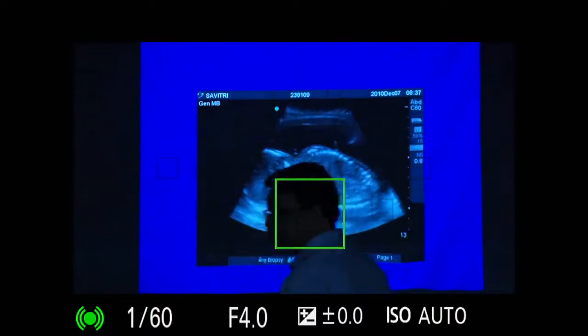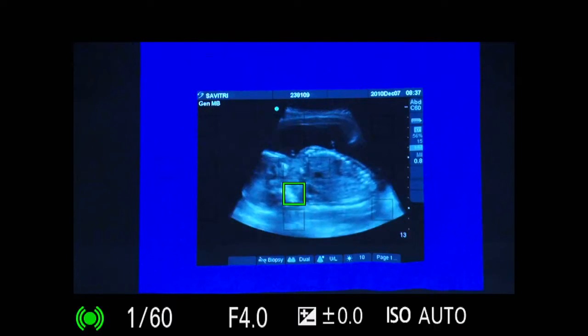For that, you can use ultrasound to find out whether the baby is alive. But in this case, the mother had fallen from the 3rd floor, and the baby was 19 weeks, so we could not save the baby. Here, within 1 minute you should see whether the baby is alive, and for viability you should see the biparietal diameter and the femur length for fetal maturity. That way you will know whether the baby will be able to live once it comes out of the mother's womb.